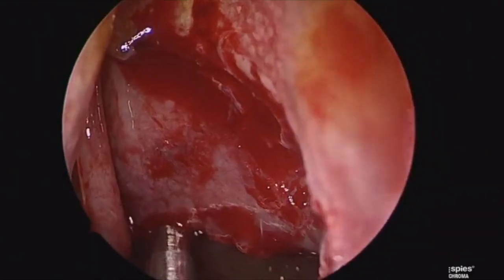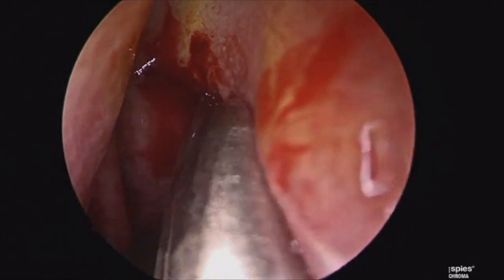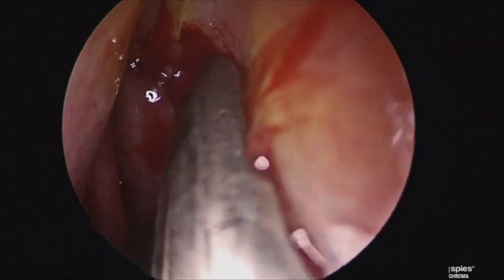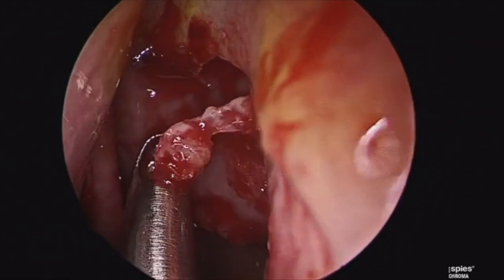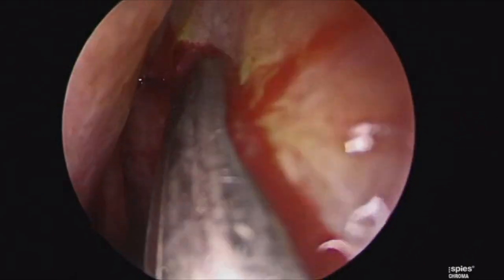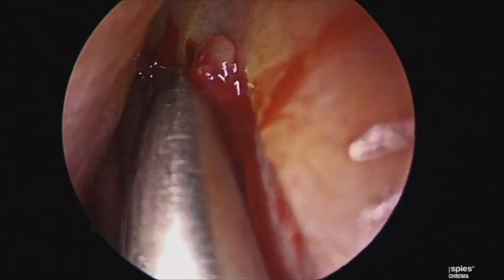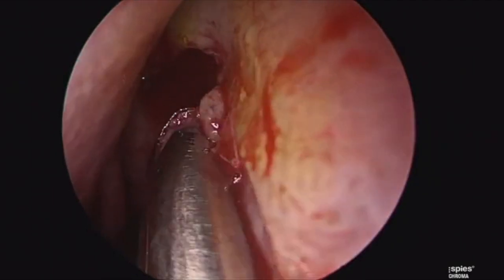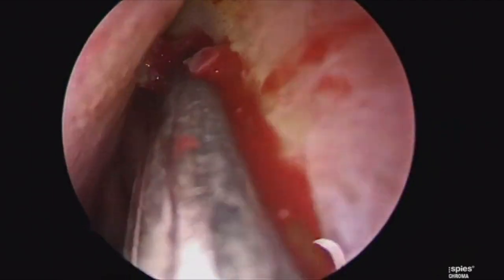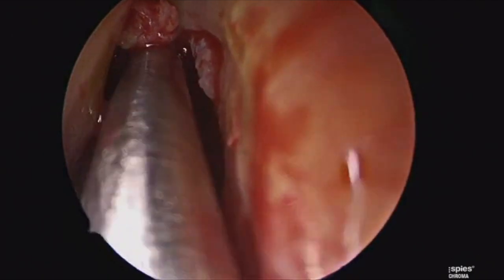Once that's trimmed completely, you can see that you have a nice teardrop-shaped antrostomy beginning with that natural ostium. At this juncture, we'll turn our attention towards the more superior aspect of the uncinate process, and we're coming in just behind that with a frontal sinus pediatric curette, taking on the last bit of that more superior attachment. We will leave a bit of the most superior part in order to help guide our frontal dissection later on.